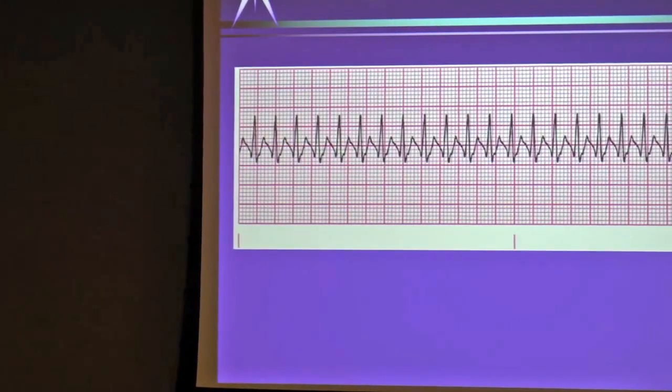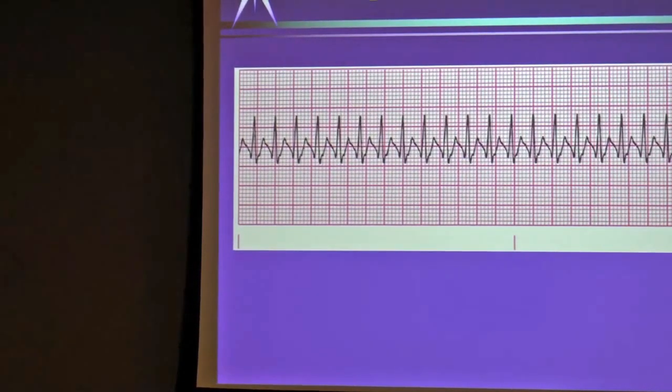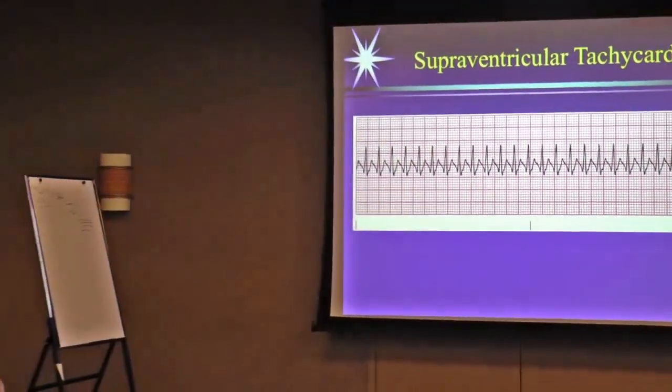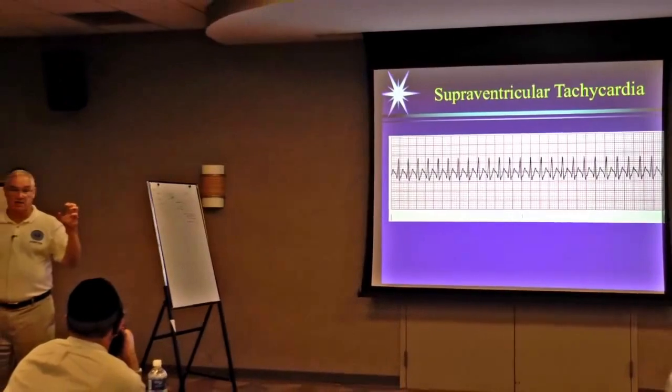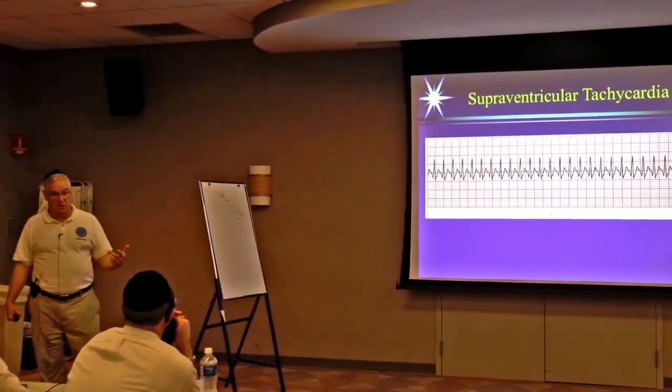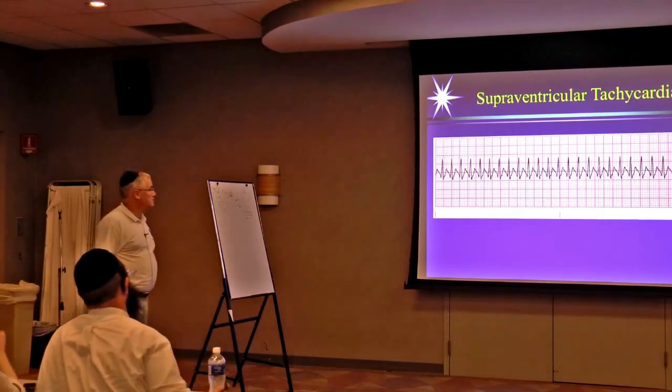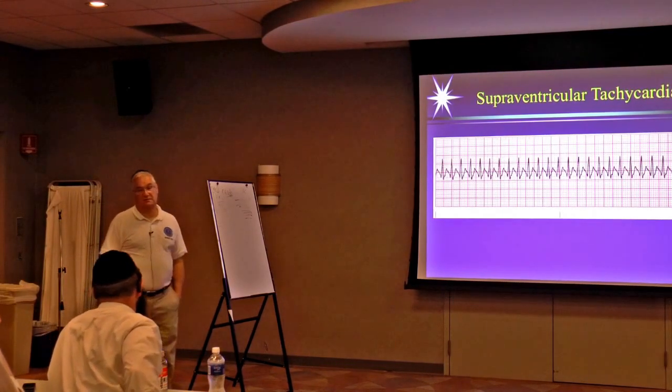What is that patient going to say to you? I have palpitations. My heart is beating. I feel dizzy. This is why they're dizzy, because they have that decreased ventricular filling time. They're not having a high enough cardiac output. Okay. So, what would it tell this versus a standard sinus tachycardia?